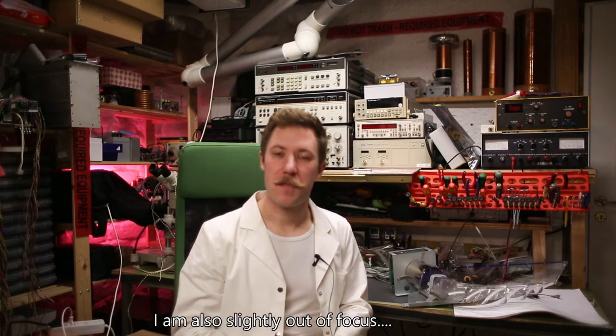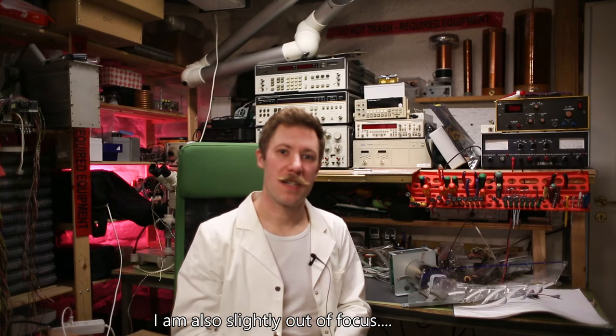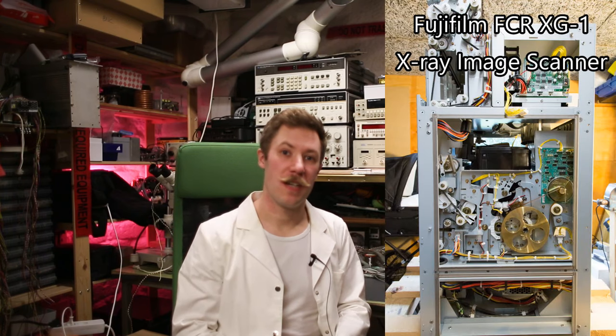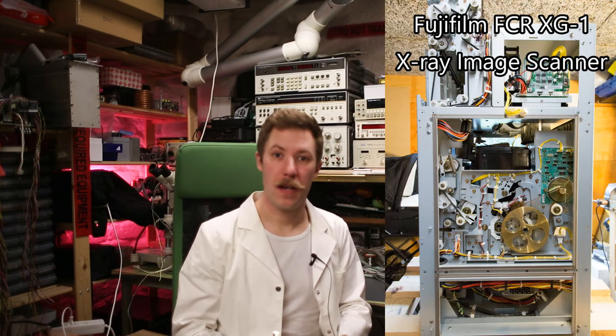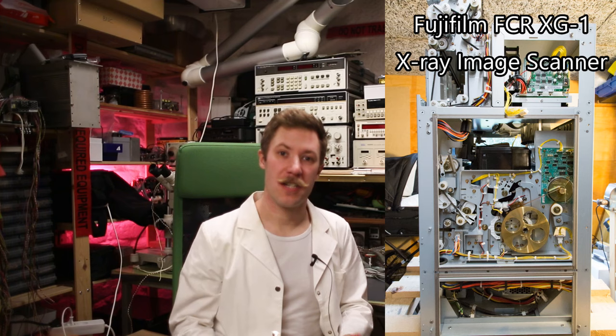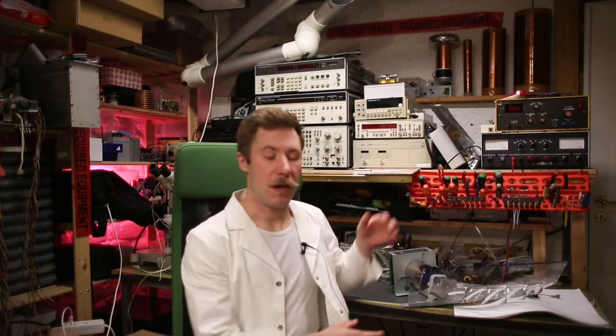Hi, my name is Mads Bahnkopp from Kaiser Power Electronics. This is part three of the Fujifilm FCR XG1 X-Ray Image Scanner Teardown, and the part we're looking at today is the PMT assembly.